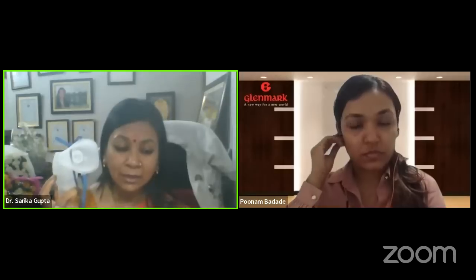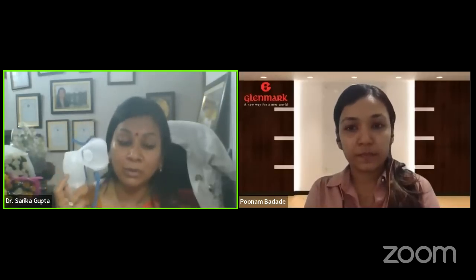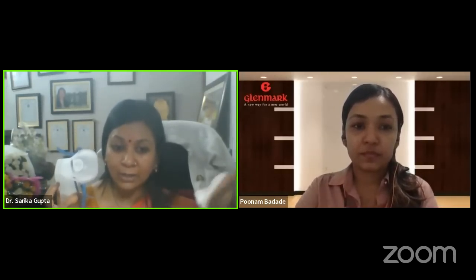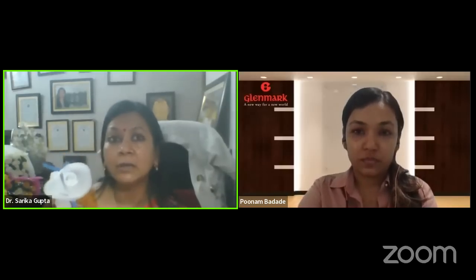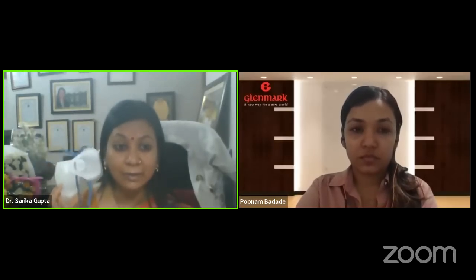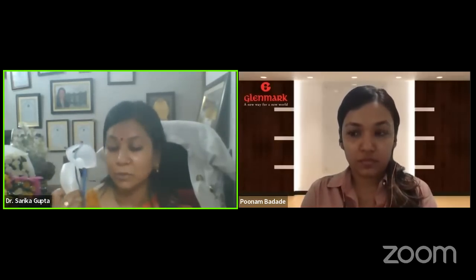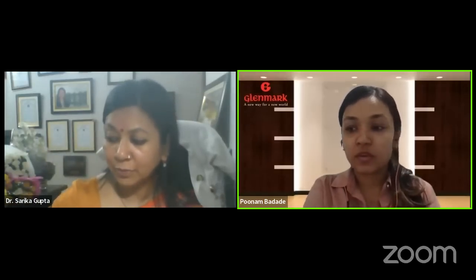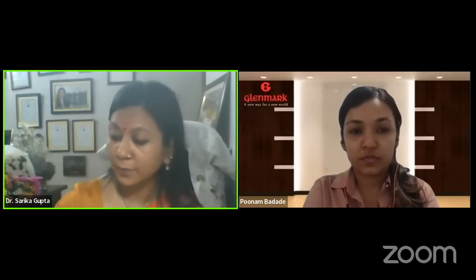If the child wants to lie down only, then raise the head end. The head end should be raised to about 50 to 70 degrees, in the semi-recumbent position. In that position. Is it clear? Yes. Okay, so no nebulization in the lying down position.